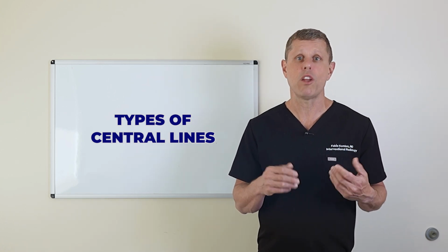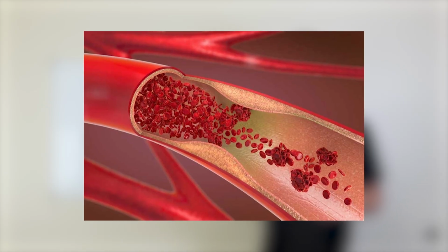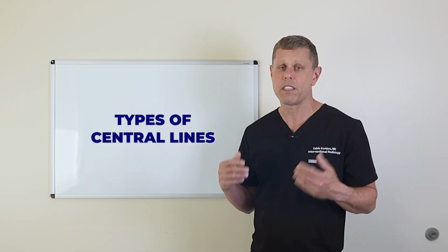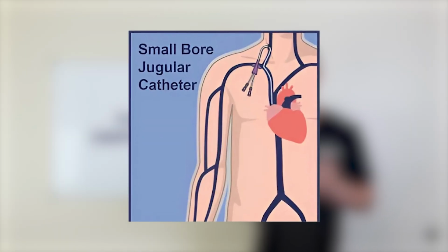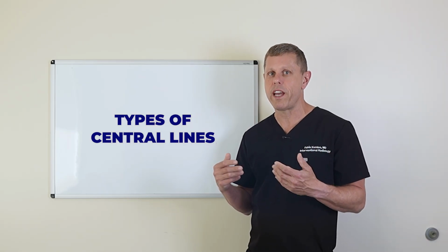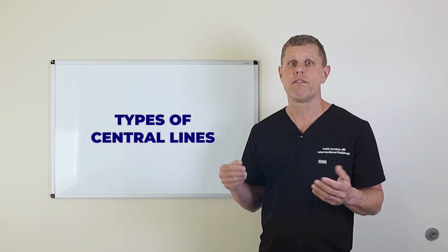But some patients may not be able to have a PICC line either because they have blood clots in the arms, or because they have narrowing in the veins, or sometimes because their arms cannot be used because they have lymphedema or some other condition. Things like that happen. So the small bore tunneled central lines, or tunnel PICC lines like we call them, they look and feel the same way as a PICC line. They're just located in the chest, and they have that little cuff that I talked about.